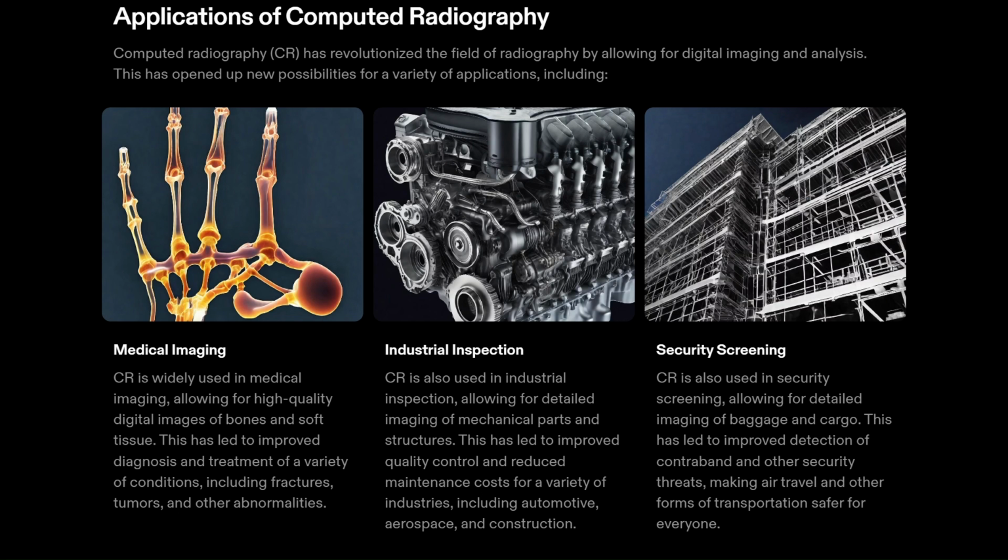And it is also used in industrial inspections. Computer radiography is used in industrial inspection for detailed imaging of mechanical parts and structures.